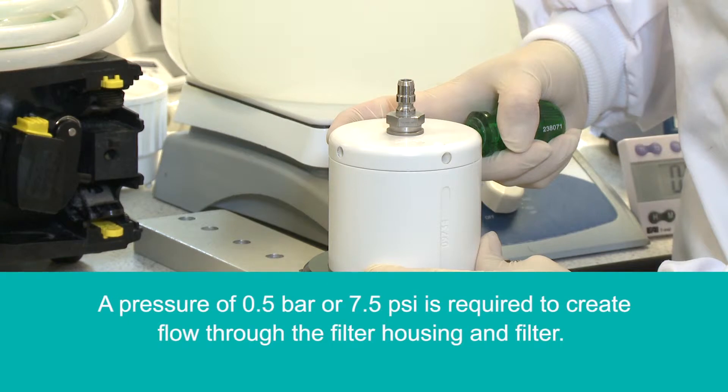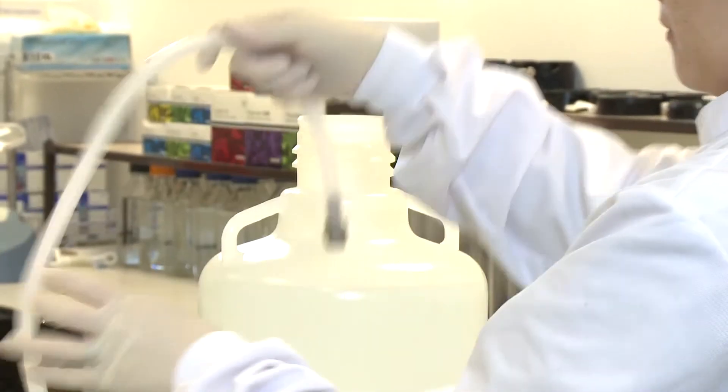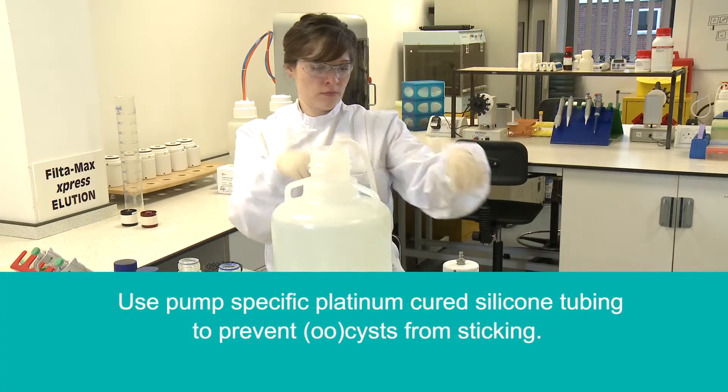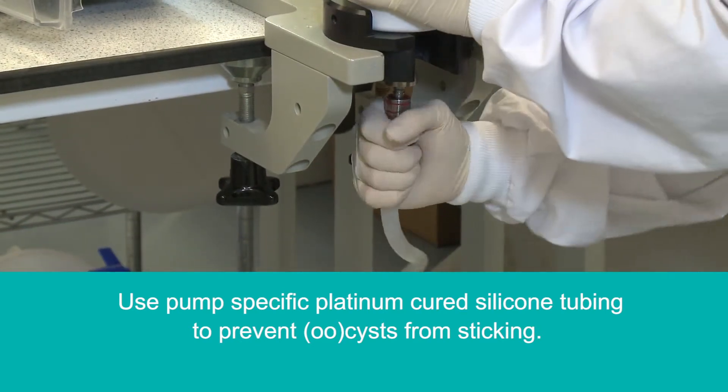A pressure of 0.5 bar or 7.5 psi is required to create flow through the filter housing and filter. Use a recommended pump system such as those supplied by Watson Marlow or Masterflex. Introduce the peristaltic tubing to the pump setup and carboy. It is recommended that platinum cured silicon tubing is used to prevent cysts and oocysts from sticking.